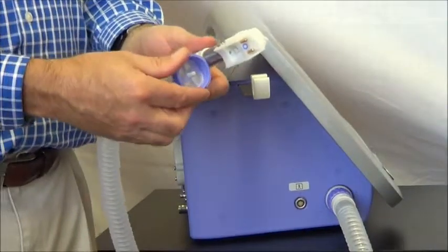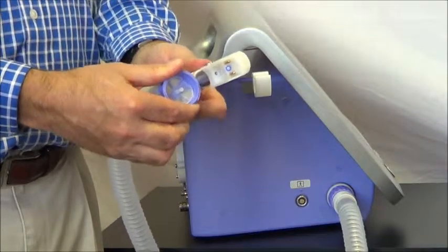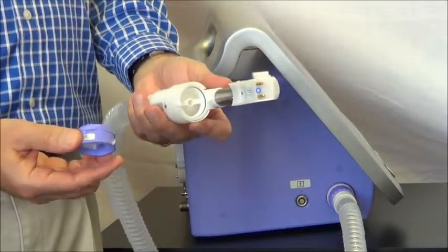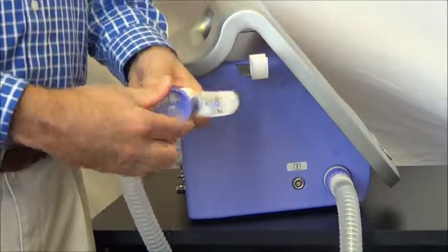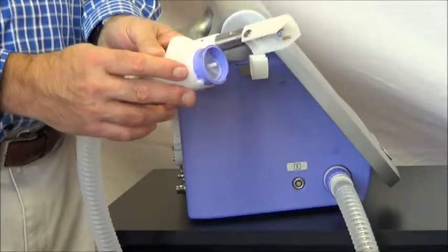The next part we're going to replace is the one-way valve — it's this purple item here. It takes about an eighth of a turn to remove. Pull that off, take the new valve, and just reinstall. At the end of the day, these two little arrows should be lined up.